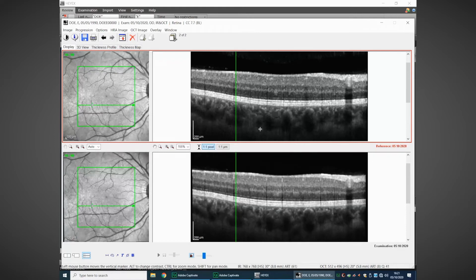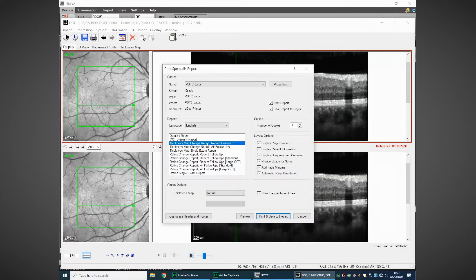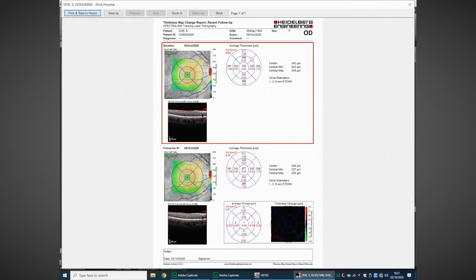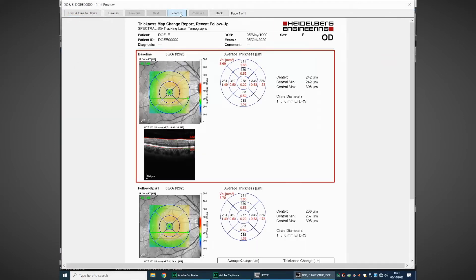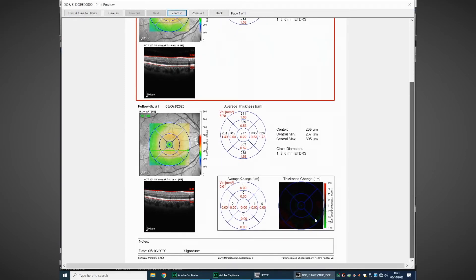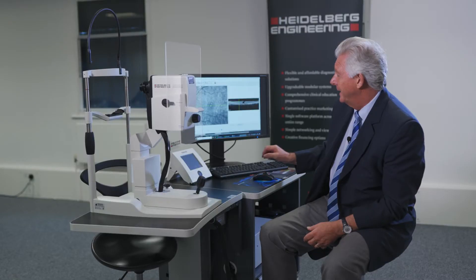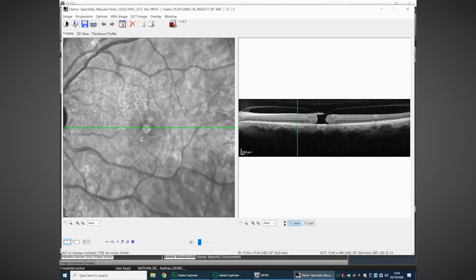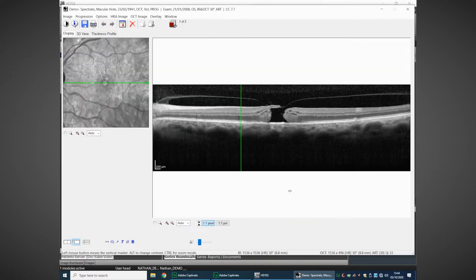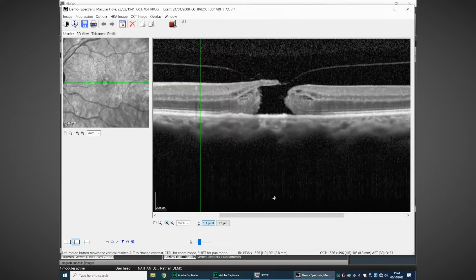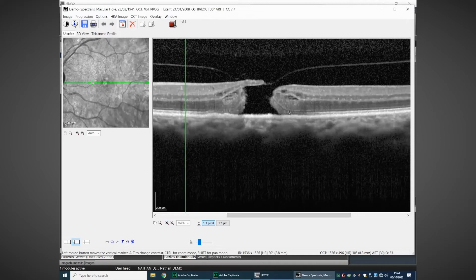Let's see how repeatable that actually is. Going to the print report, here we have our baseline exam and our follow-up exam. Zooming in, you can see the difference map — every sector is within zero or one micron reproducibility. Let's look at this patient who seems to have some pathology. It looks like a macular hole from the infrared reflectance image. Looking at the OCT, we can see very nicely that it appears to be a full-thickness macular hole. We can magnify and see in great detail that the external limiting membrane is still preserved, suggesting a good possibility of vision recovery if the retina can be repositioned.